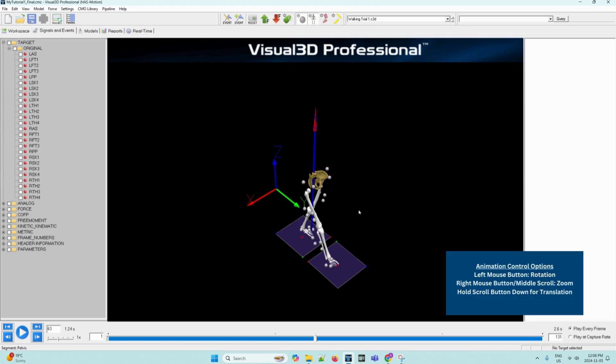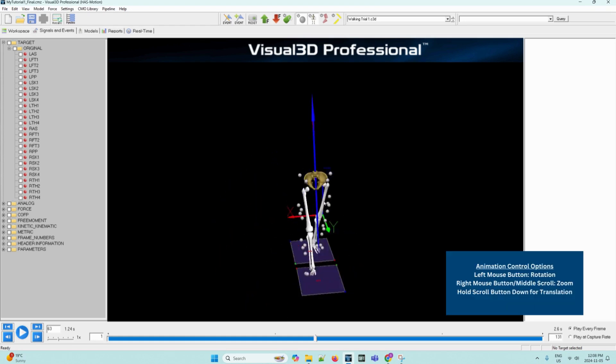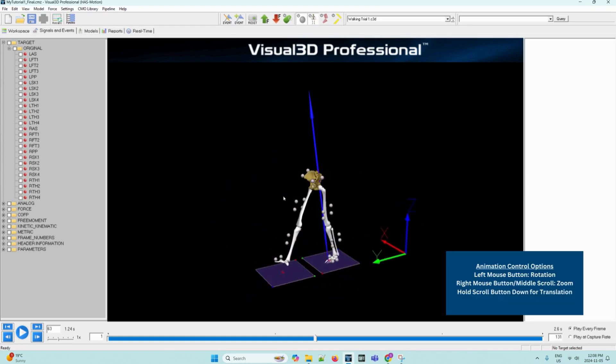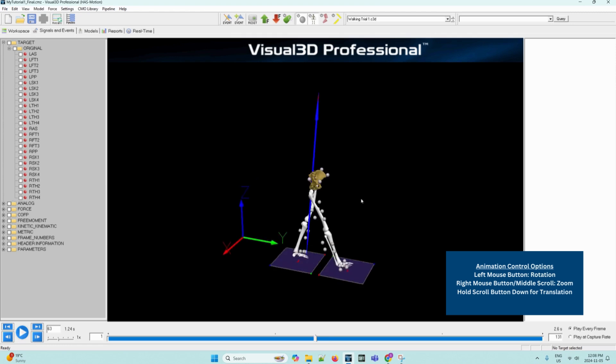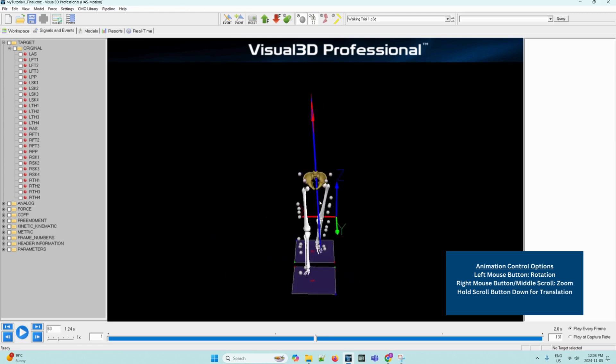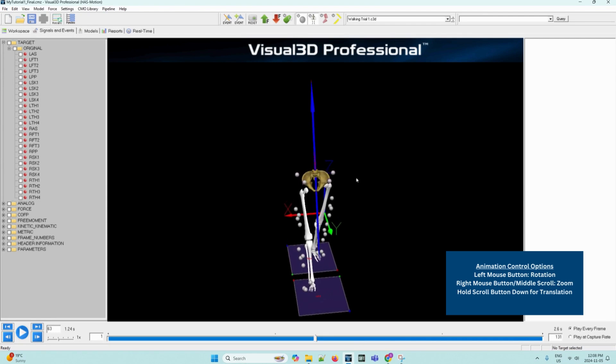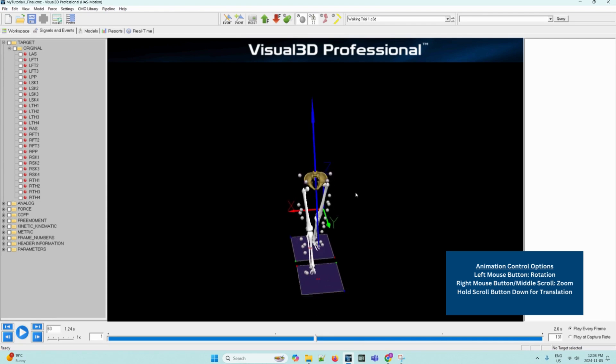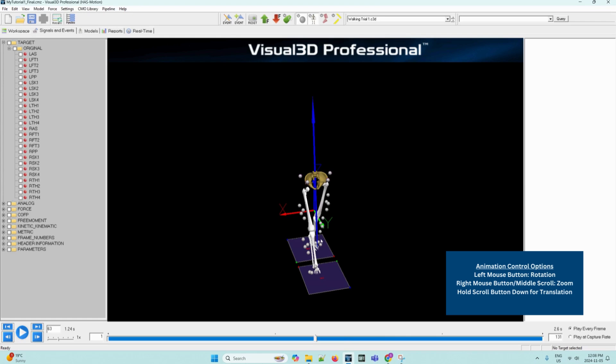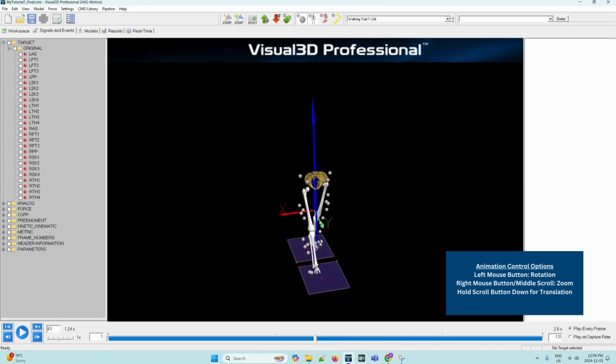Firstly, the left mouse button is for rotation. So if you were to move it around, the model rotates with the mouse. And then holding the right mouse button down and moving it around is to zoom. The same feature can also be used with the middle scroll button on the mouse.